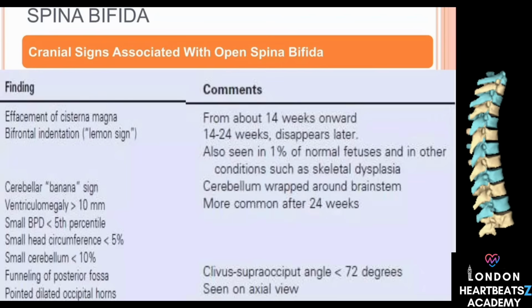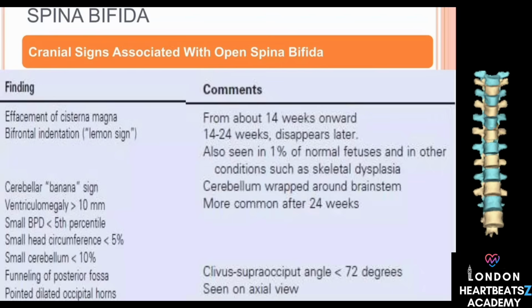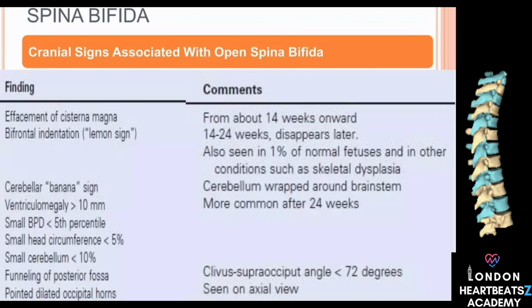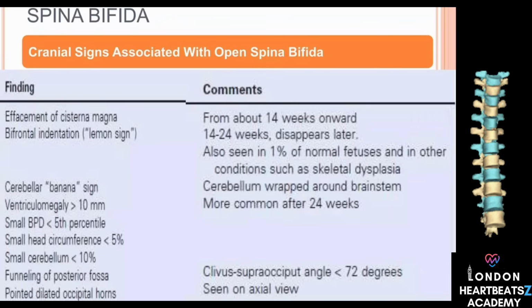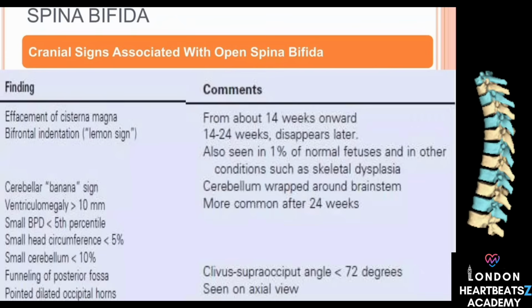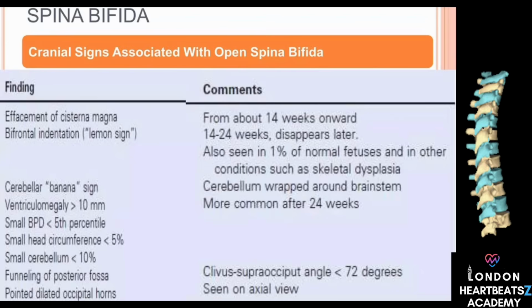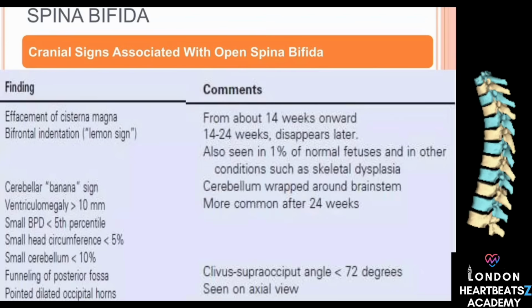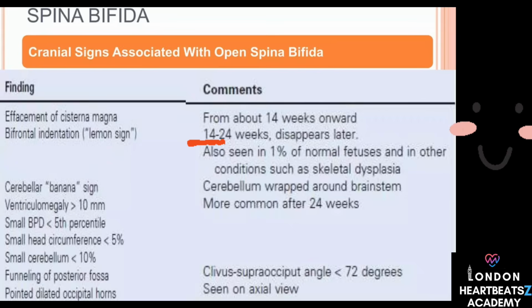These are specifically looked for during the cranial assessment as they are strong indicators of an open spinal defect lower down. Although the specific visual details of these signs aren't provided in the text here, the scan protocol explicitly includes looking for these cranial markers because they are highly sensitive for identifying spina bifida. Okay, so they're looking for indirect signs in the head that point to a potential problem lower down in the spine. That makes sense. Moving down from the head and the brain, let's turn our attention to the fetal face.